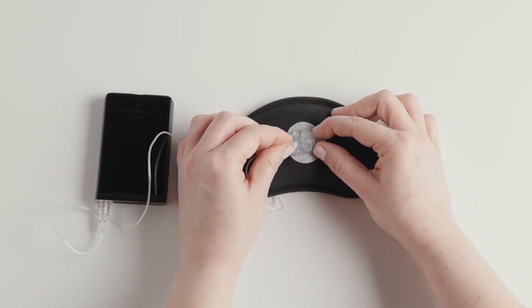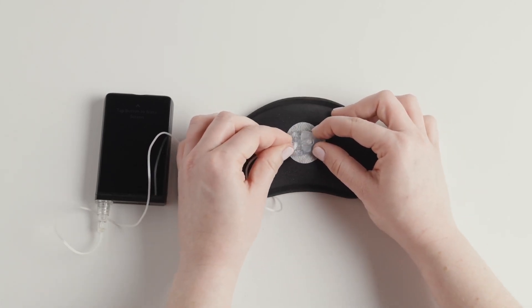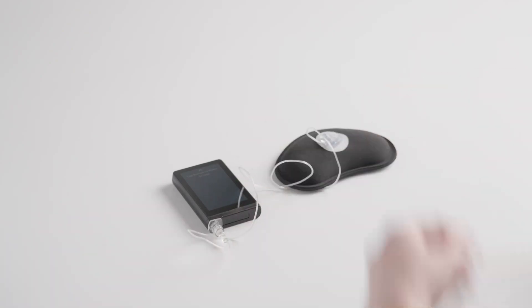Make sure to push the tubing straight into the infusion set base, not at an angle. You'll hear it click when it is fully snapped in place.